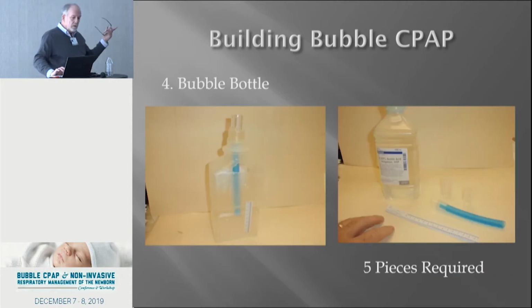So you also see at the top of the chamber on the left side of your screen, I have to think because that's different for me and you, there's a hole cut into it. There's a hospital in Baltimore, GBMC, I think. They don't cut a hole in it. They just put something in the top of there to secure that, and then the expiratory gas comes out the top of the bottle. But it has to have somewhere to go to get back to the atmosphere. So either one of those, it would be up to you. The commercially available ones, they're built in.